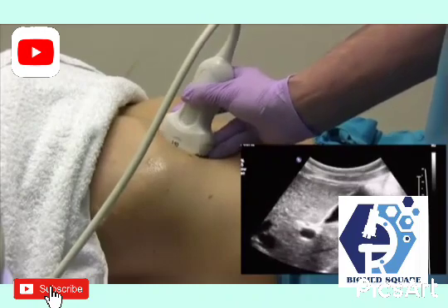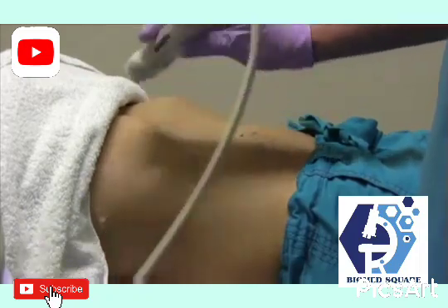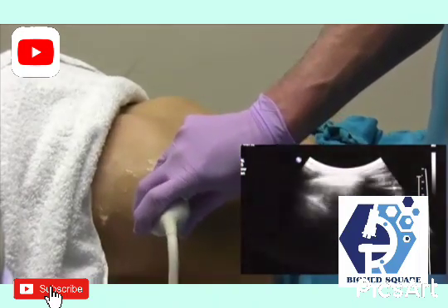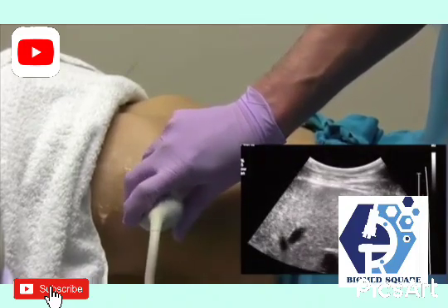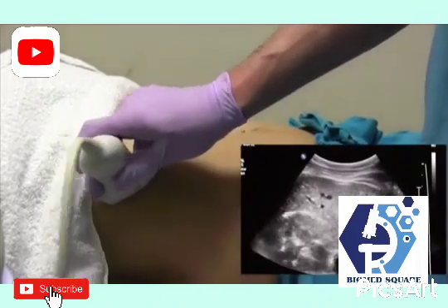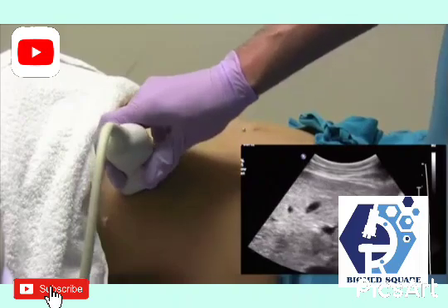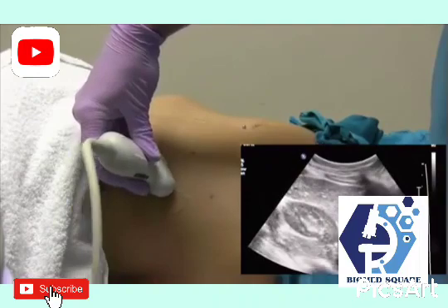Another real good window for the gallbladder, especially for bigger patients or gassy patients, is if you come intercostal and you're going to angle up towards the anterior part of the abdomen. Again, you're just going to open up the gallbladder to get its widest portion here. And same thing, once you find that sagittal window, to get a transverse, look at your probe and turn it 90 degrees to that plane.